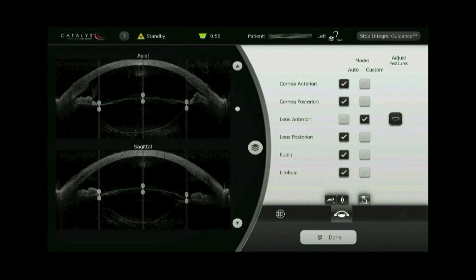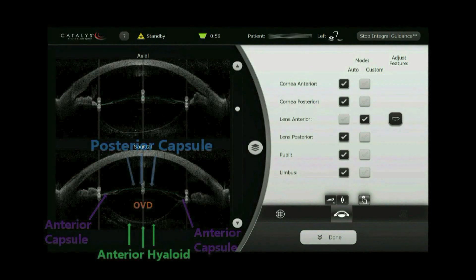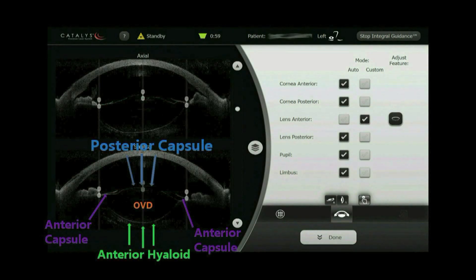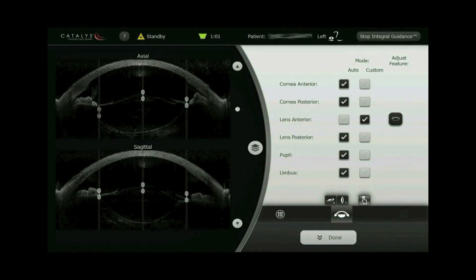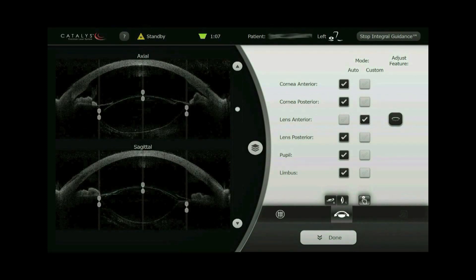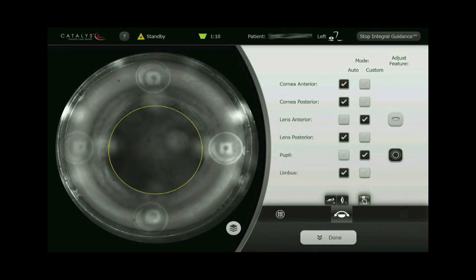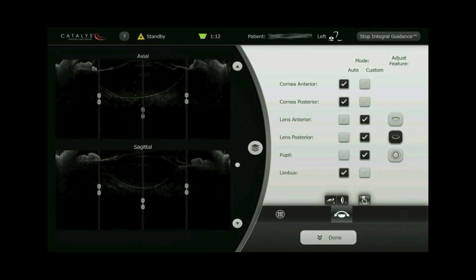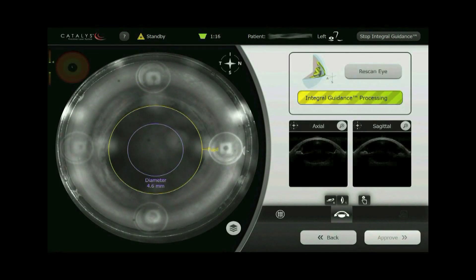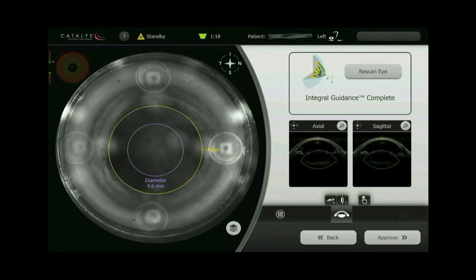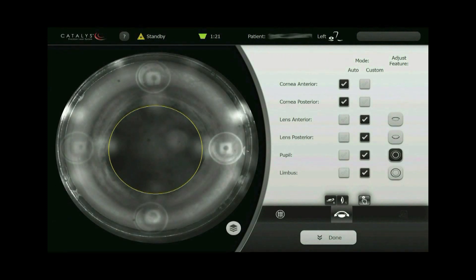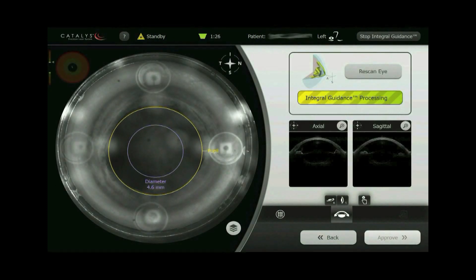The high-resolution axial and sagittal OCT images show the less than 5 micron thick posterior capsule in a convex shape, the anterior hyaloid in a concave shape, and the OVD-filled space between them. The convex surface in the anterior image is customized and interpreted as the anterior capsule, the concave surface in the posterior image as the posterior capsule, and the space in between as the lens. The automatic detection of the pupil is confirmed to ensure centration and concentricity of the two capsulotomies.